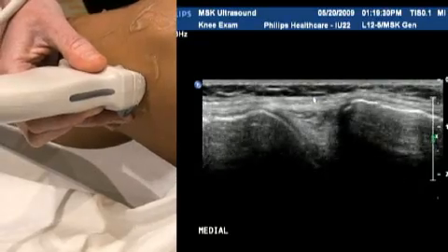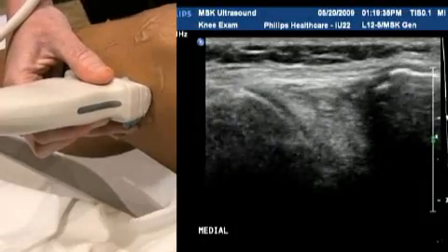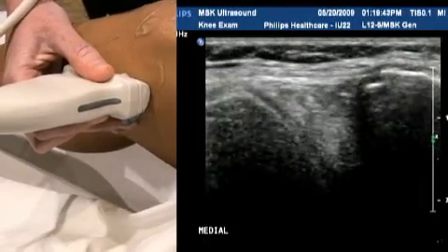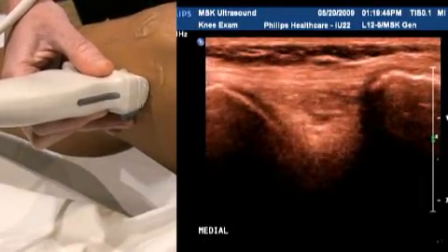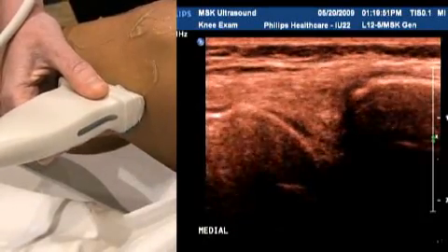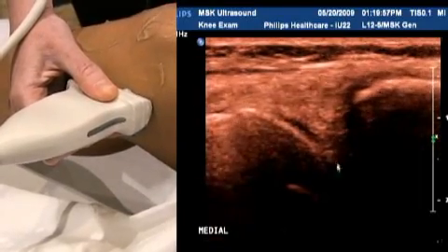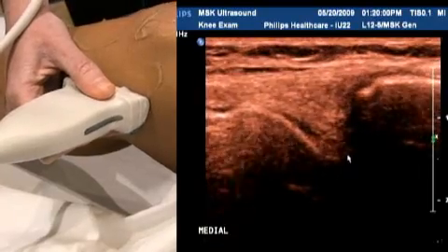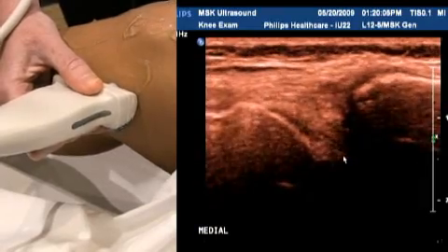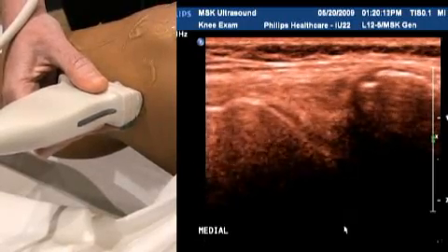Be sure to really zoom in on the meniscus as much as you need to — using HD zoom is ideal. The chroma is something that may also help in your assessment. You can look from posteromedially at the meniscus if there's a particular area of interest, especially deep down. If that's something of particular clinical interest, you can roll the patient slightly onto their side and approach from more posteriorly, though I find the medial approach quite effective in most patients.